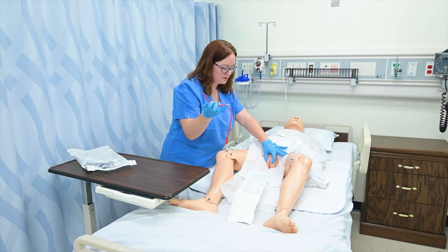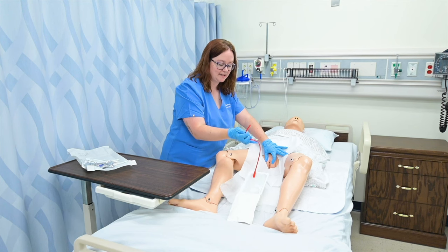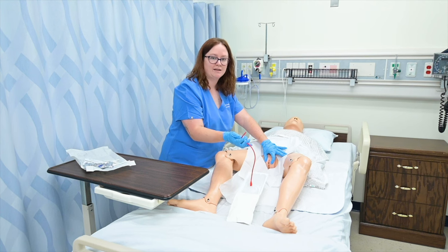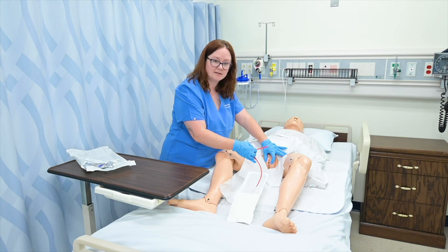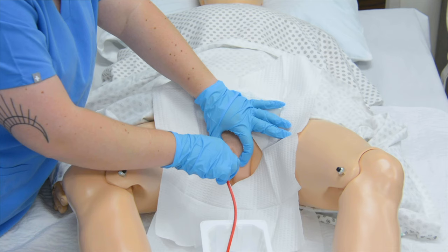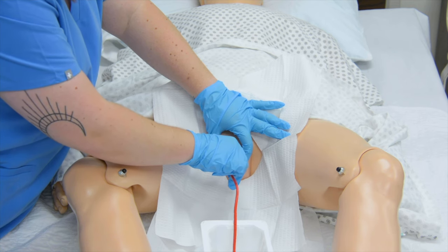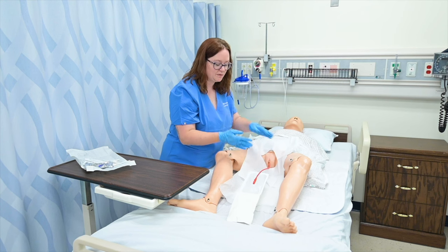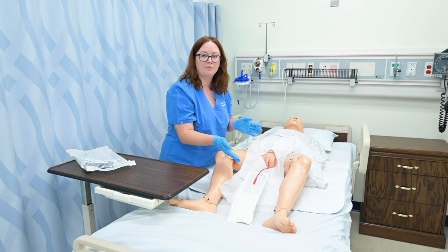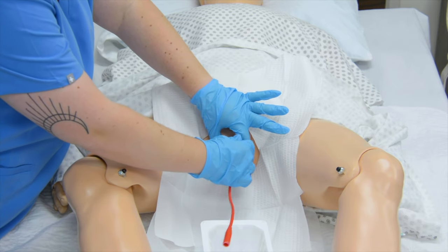So all you need to be wary of is that this end of the catheter must be in a container to catch that urine. And the container that these kits come in is built for that purpose. They're hard plastic, so you can just leave that end in the hard plastic container while you insert the catheter into the urethra, and at some point urine would start exiting and you would simply wait until the urine has completed. Once that's completed, you simply withdraw the catheter.